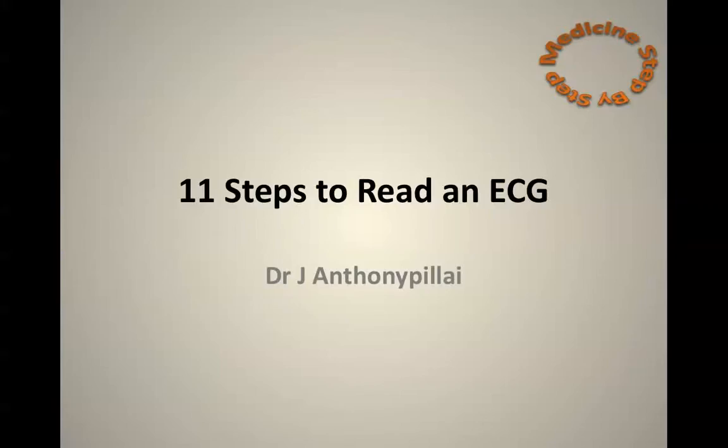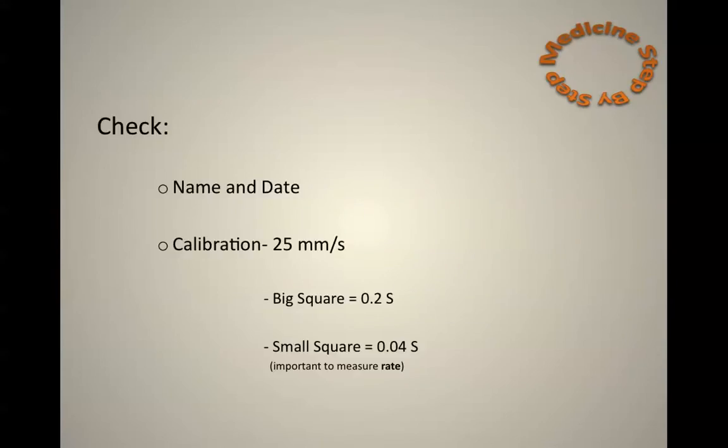Hello everyone. Today I'm going to go through the 11 steps to analyse an ECG. First, a few basic principles you should apply to anything that you assess.